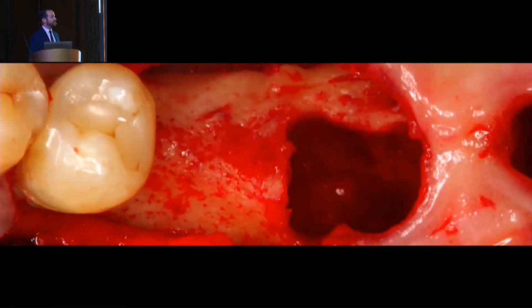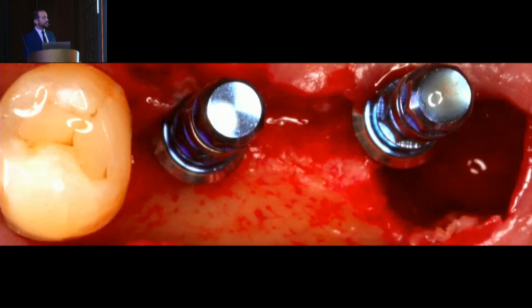Here we have the clinical picture after extraction of both the second and the third molar. And here we have the implant placement, implant placement on the second molar in a semi-immediate implant position. And here we can see the implant on the first molar completely surrounded by bone, but we can still see that deficiency on the buccal side.